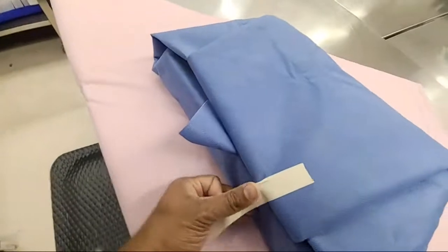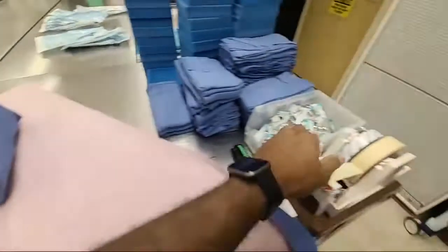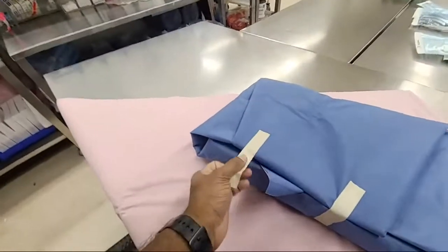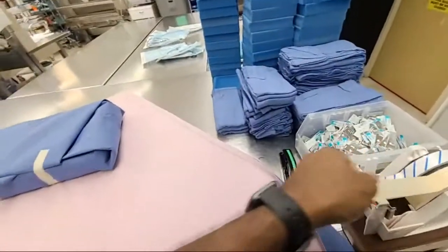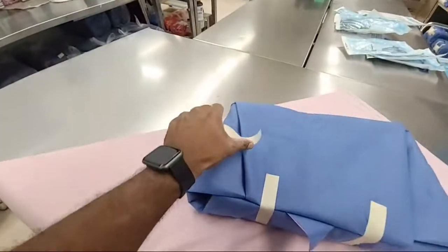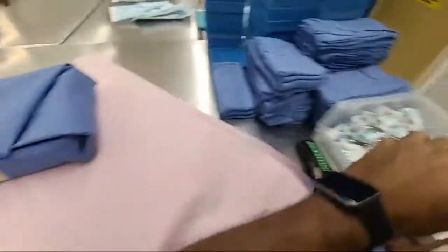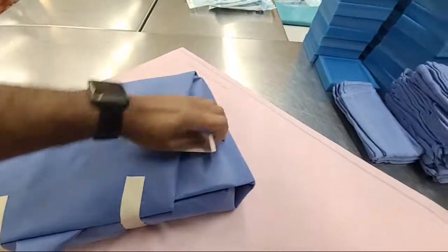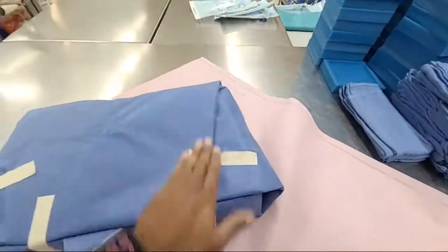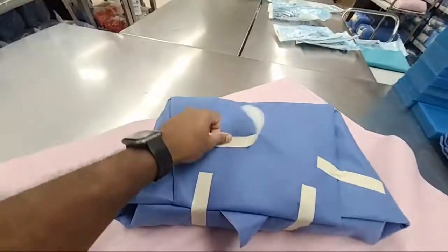And then we're going to secure each side down. This is not bad for a one-handed job. I've got to say, it's pretty good actually. I thought it was going to be worse. It was terrible, but still not bad. Let's get this side. We put one on each side, so this is not going to unwrap on us. And then one more across the top.